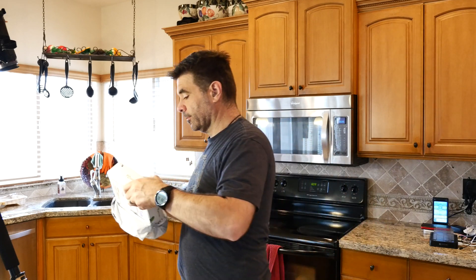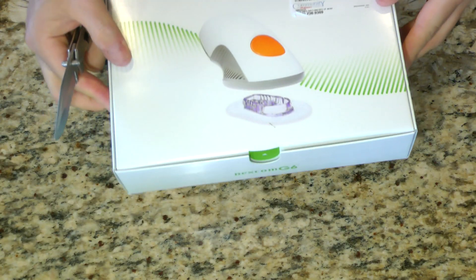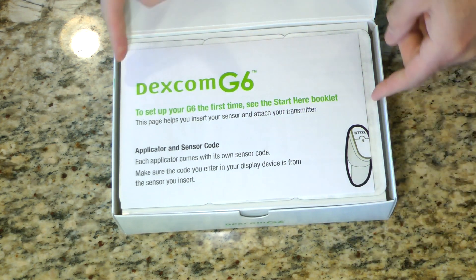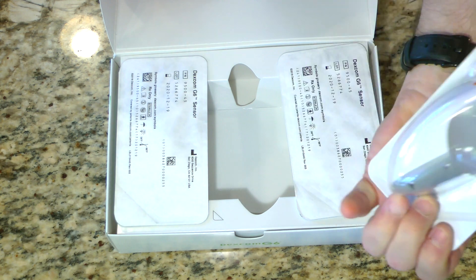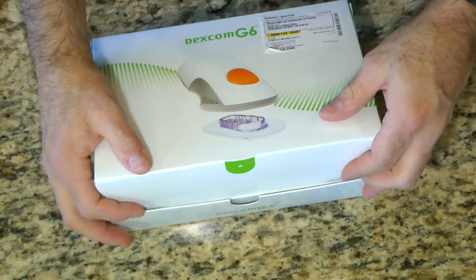Next we have a similarly shaped bag from Dexcom. This looks like it's the sensors and transmitters. Let's open that up and see what's inside. Set up your G6, start here. So we've got three sensor packs. That's everything you get with the Dexcom G6.